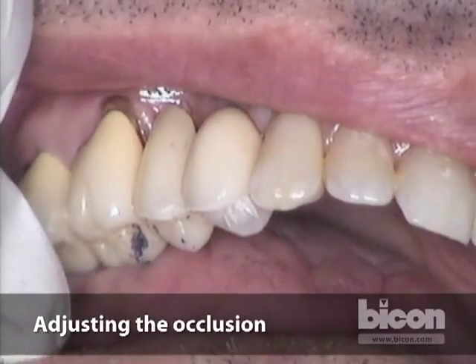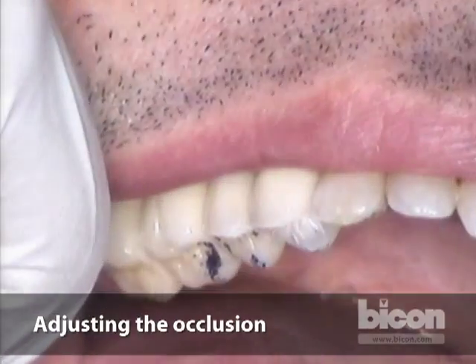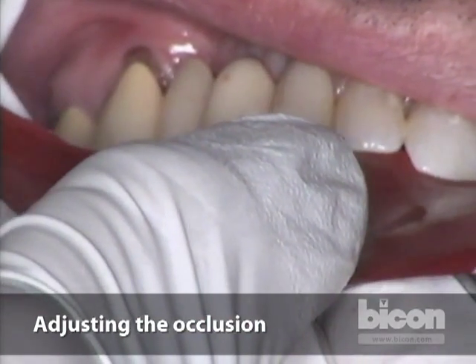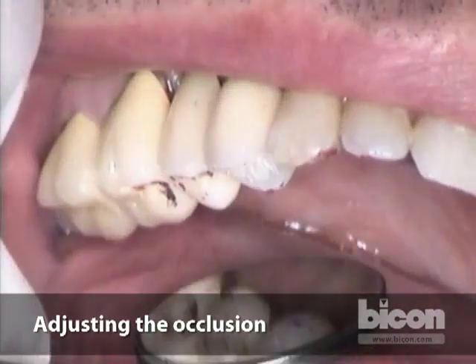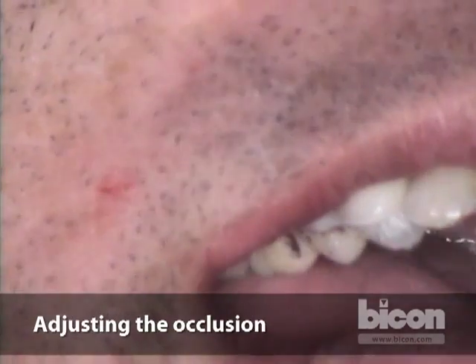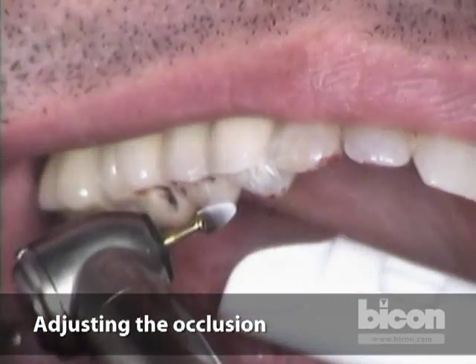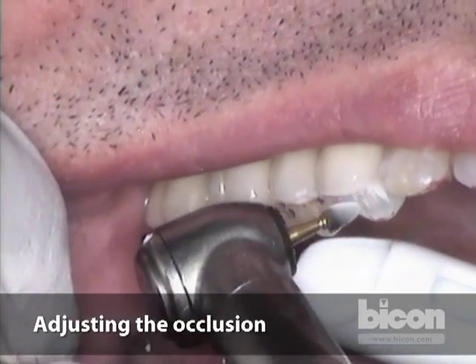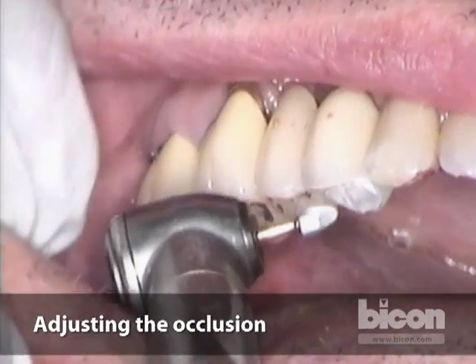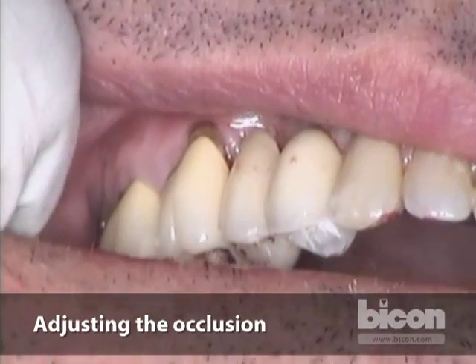Then we check occlusion one more time — that's perfect. Now bite down, grind left, right, front, back, open. I want to see if the tooth is guiding — it's guiding slightly towards the distal facial, so I'm going to grind it a little bit, because I don't want guiding contacts. It's obvious this tooth is guiding with the adjacent ones, so it's clearly group function, but in any case I want to adjust it there.